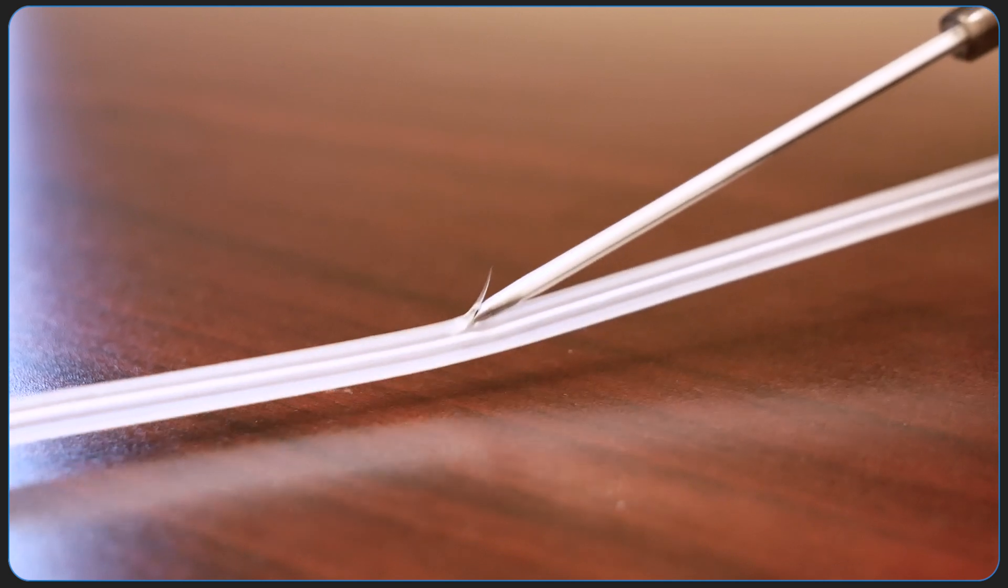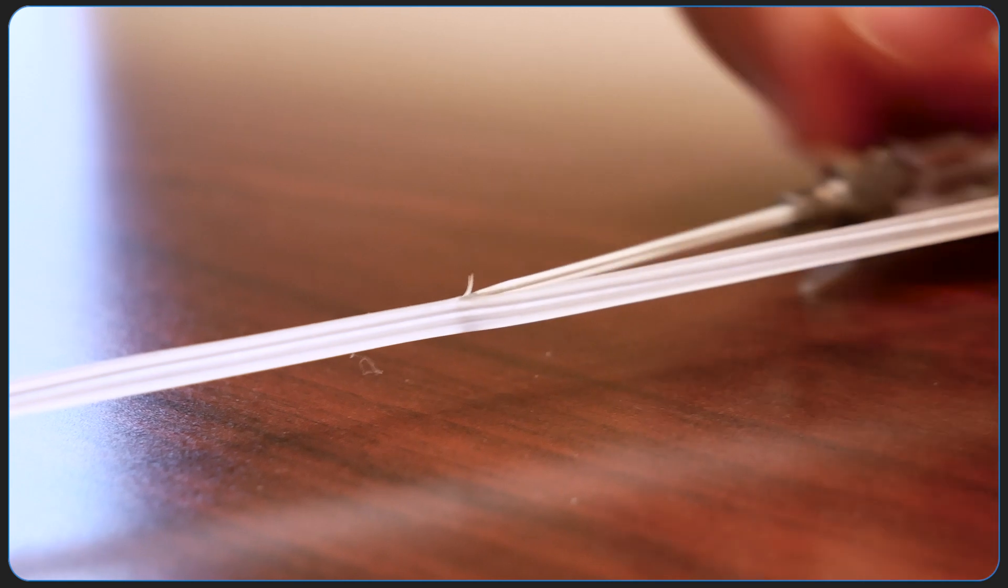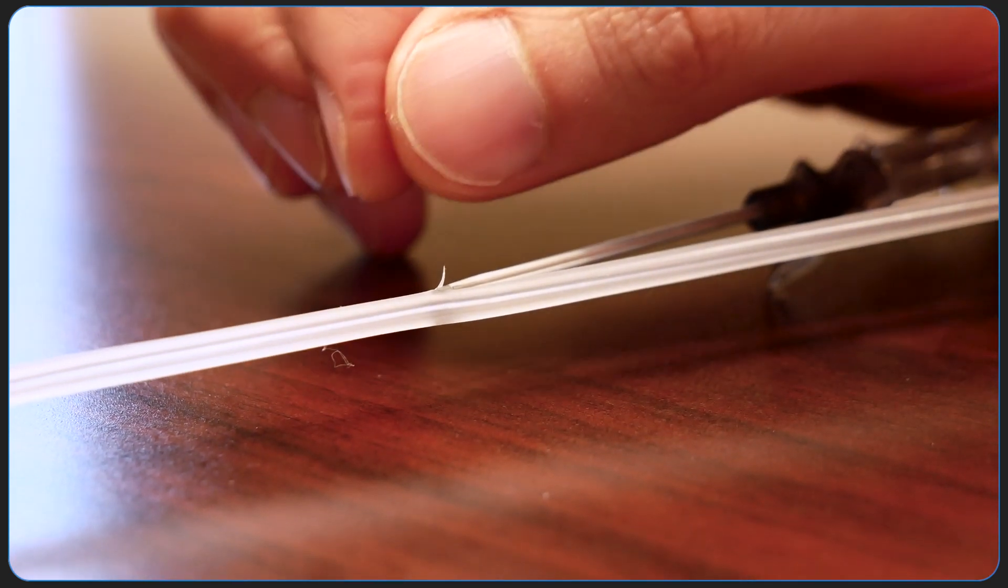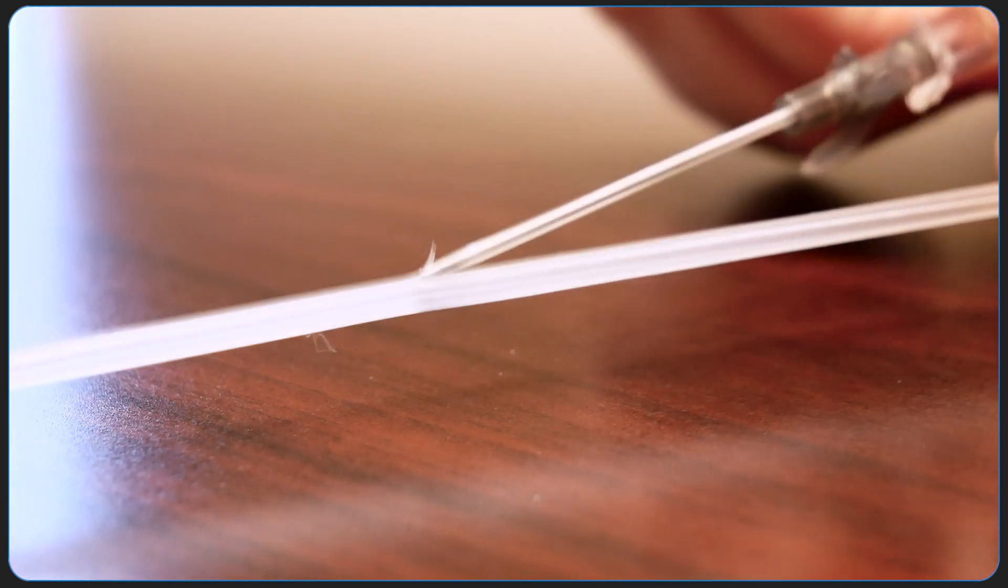Sometimes here you'll start bleeding so oftentimes I'll actually do a little quick advancement with my fingers. Once I get the tip close to the vein wall I just nudge it in.